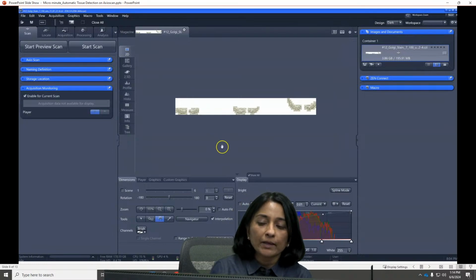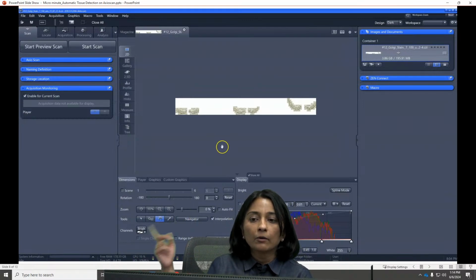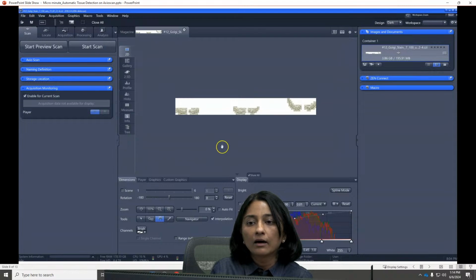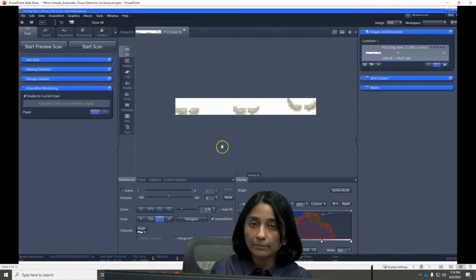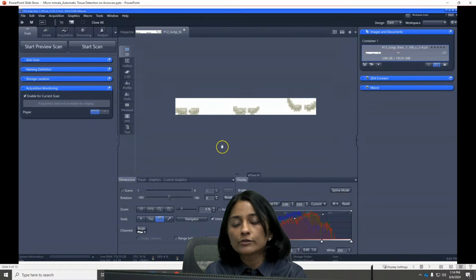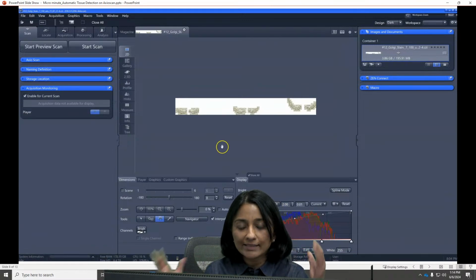So you have on one end, it detected the entire tissue, versus using an AI model that you can incorporate in your scan setting and scan profile. You can just detect the individual subregions and then scan just the subregions. Of course, you can then start thinking about what we have done: you can set a Z-stack.